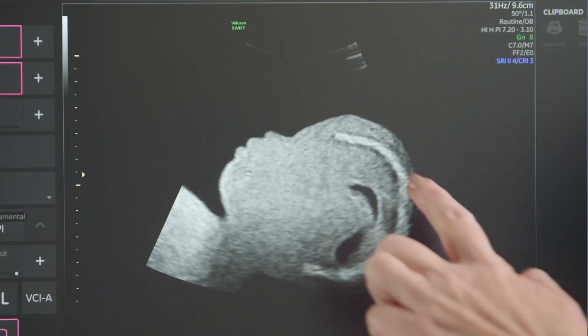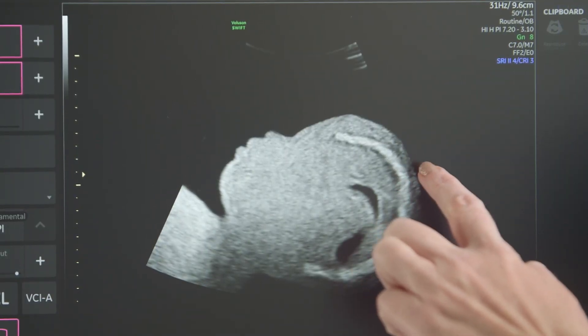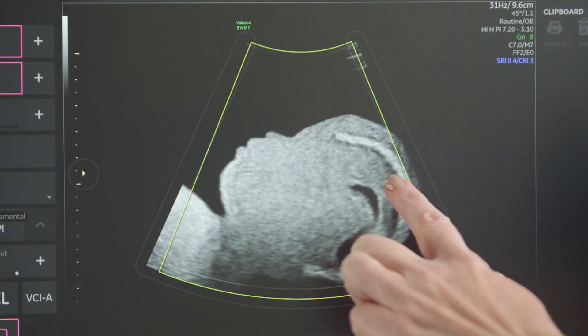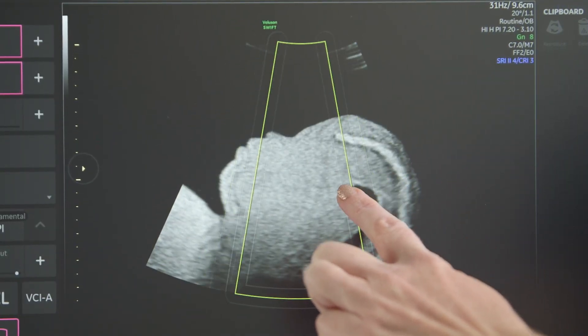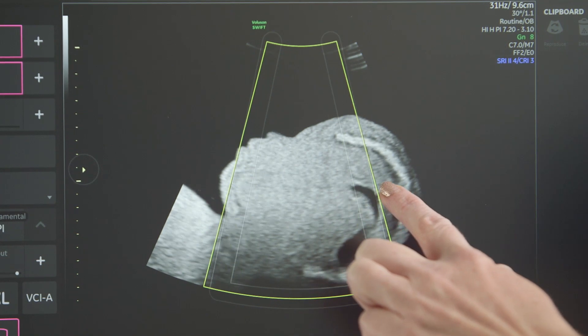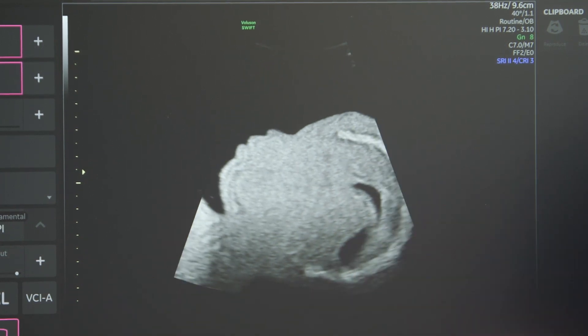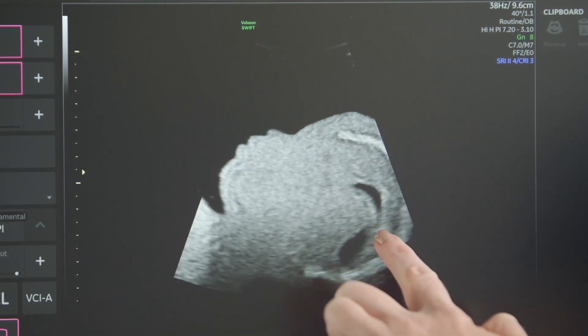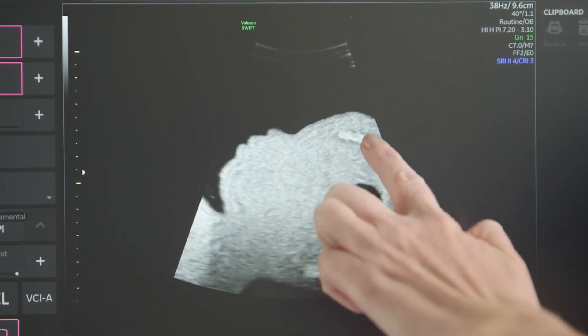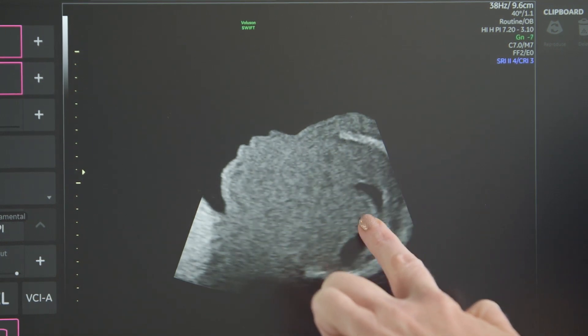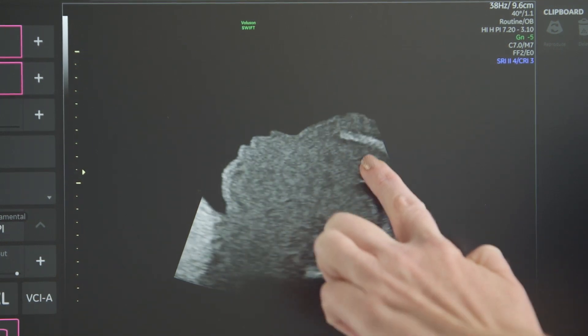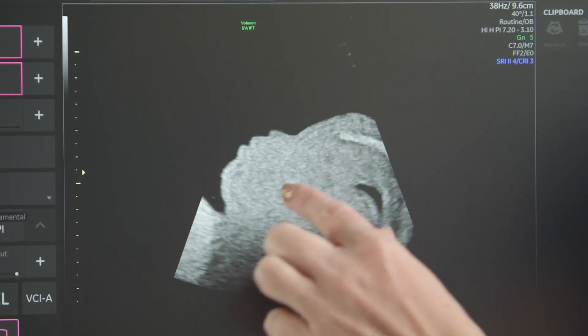On-screen imaging controls can be accessed by tapping the imaging screen to display the overlay graphics. 2D touch controls include sector width, depth, gain, zoom, and more.